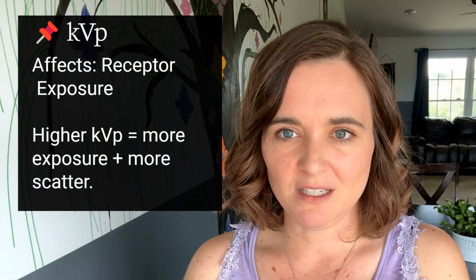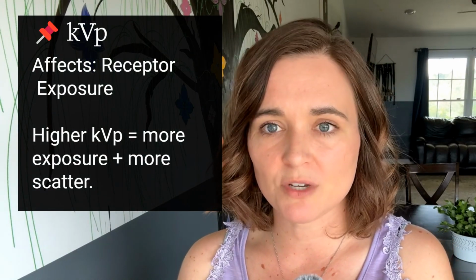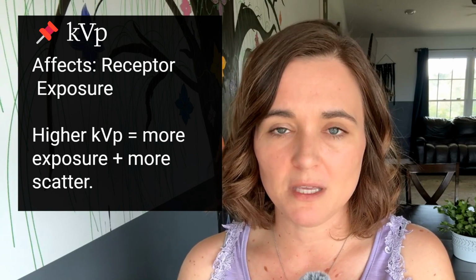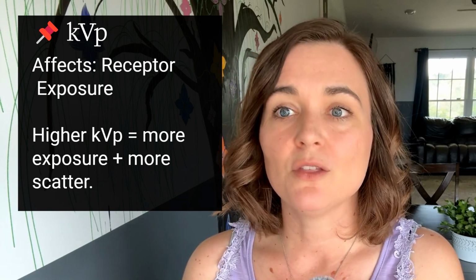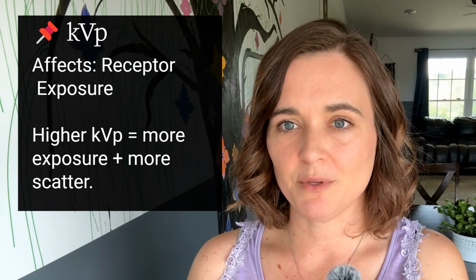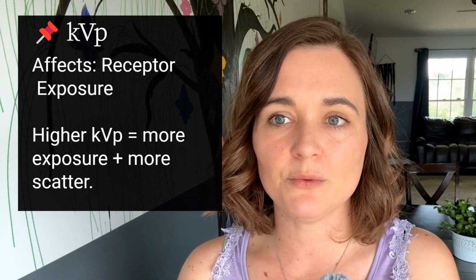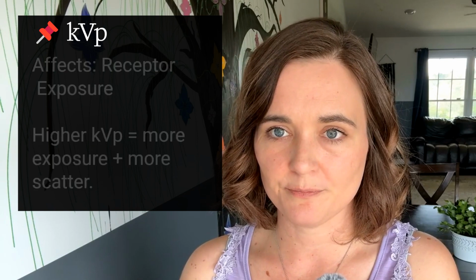Next up is KVP. This affects your receptor exposure. It controls the penetration power of the beam. The higher the KVP, the more exposure, but also the more scatter. Here's a tip. KVP impacts both brightness and contrast. Only receptor exposure is charted.